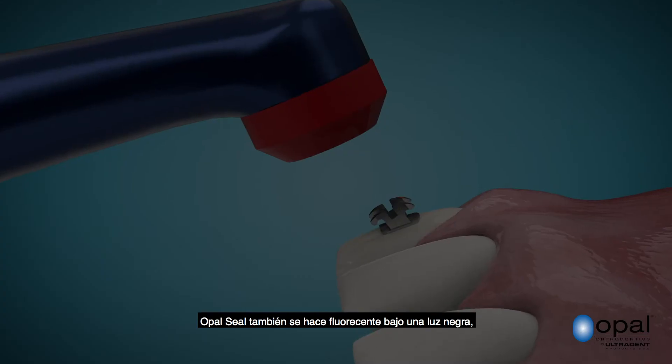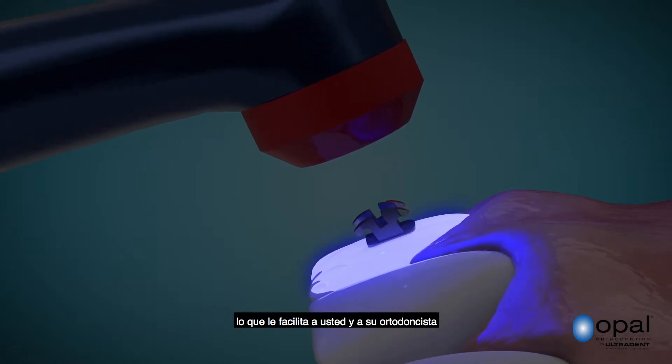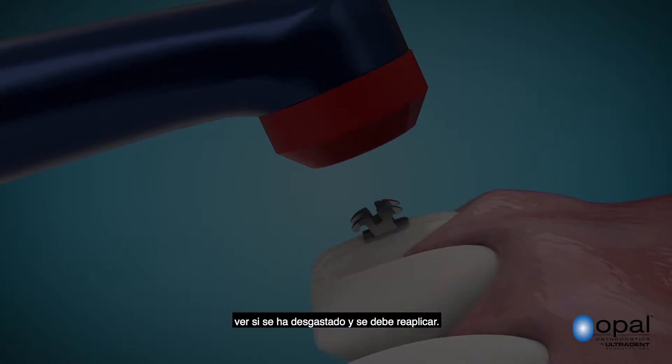Opal Seal also fluoresces under a blacklight, which makes it easy for you or your orthodontist to see if any has worn and needs to be reapplied.